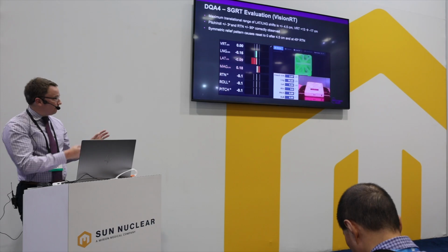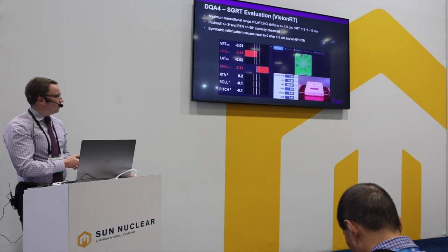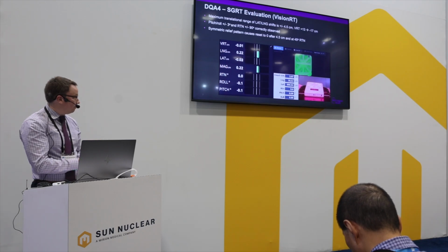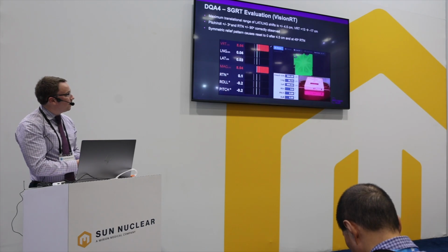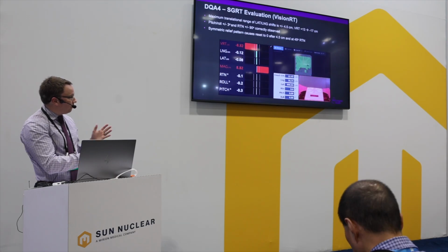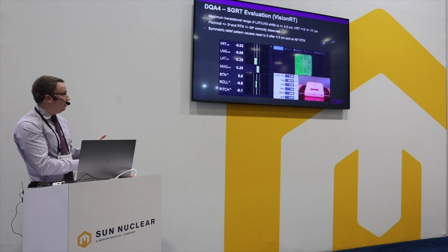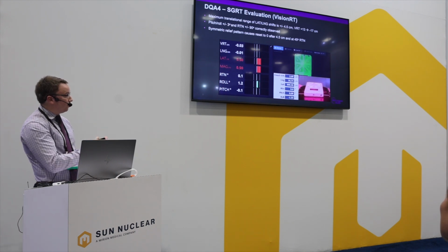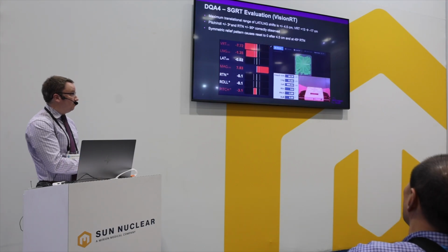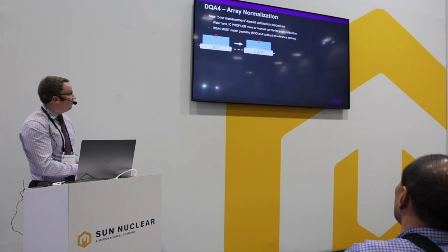Also, when you rotate 45 degrees, due to symmetry, it starts to pick that up as 0, but it picks up perfectly once you hit 90 degrees because the SGRT system is able to recognize that. And here you can see that I'm moving it around and working with the actual machine. When I was doing this, I realized it was really the first time that we have linked our IGRT system with our actual couch movements with our SGRT system. We haven't really tested pitch and roll and yaw with everything all in one phantom.